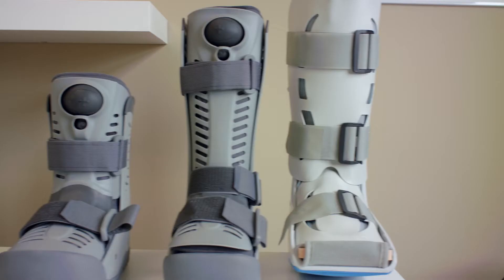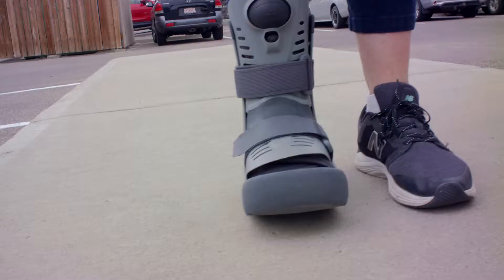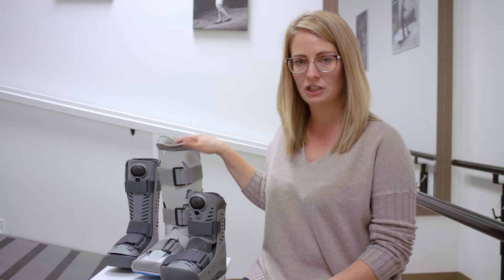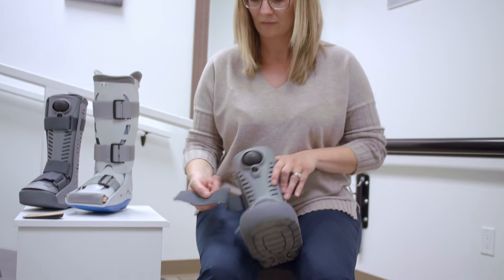You can see the differences in height. The short one would be for anything below the ankle, and the tall ones would be for anything above. So if you have a torn ankle or a broken bone in the ankle, you need to go with the high boot, unfortunately.